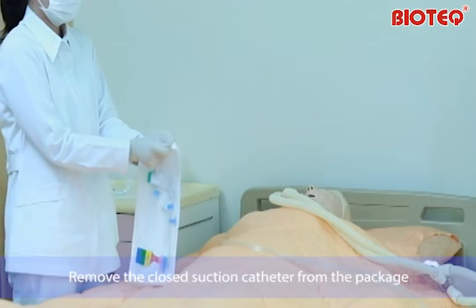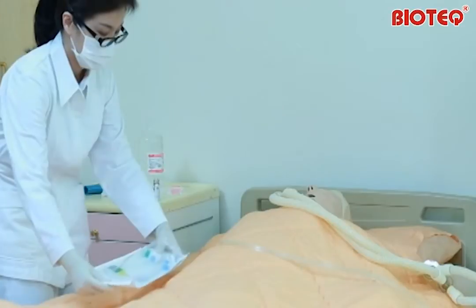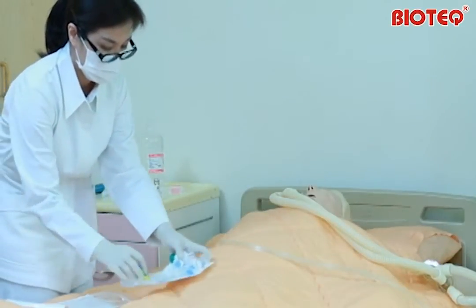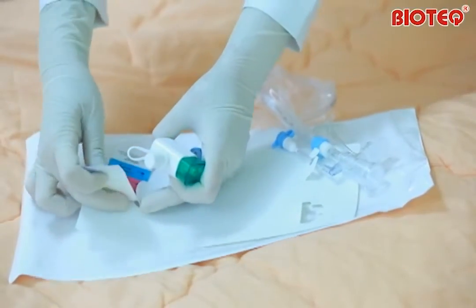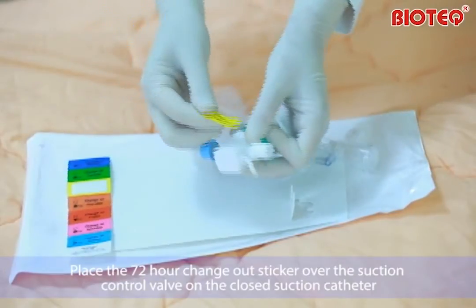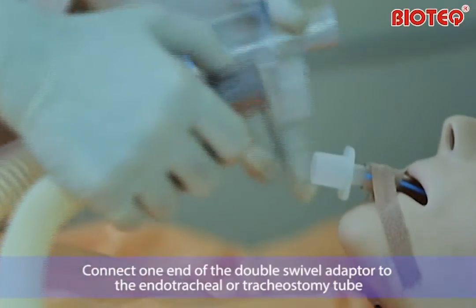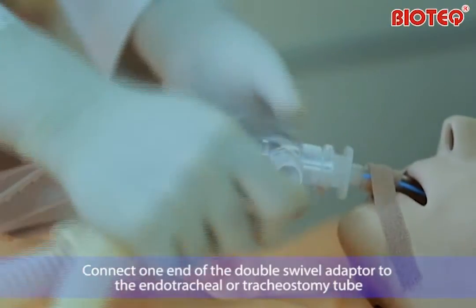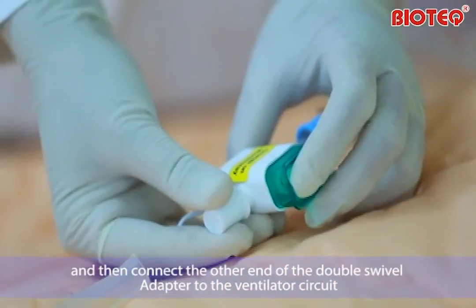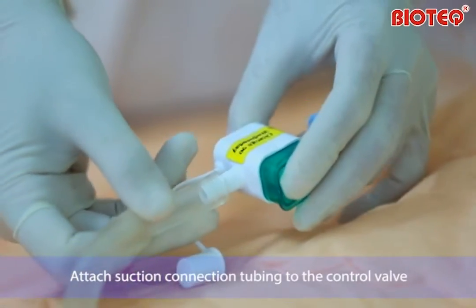Remove the closed suction catheter from the package. Place the 72-hour change-out sticker over the suction control valve on the closed suction catheter. Connect one end of the double swivel adapter to the endotracheal or tracheostomy tube, then connect the other end of the double swivel adapter to the ventilator circuit. Attach suction connection tubing to the control valve.